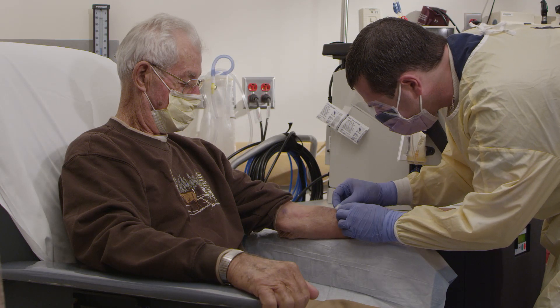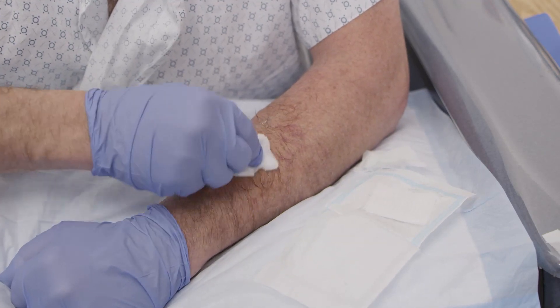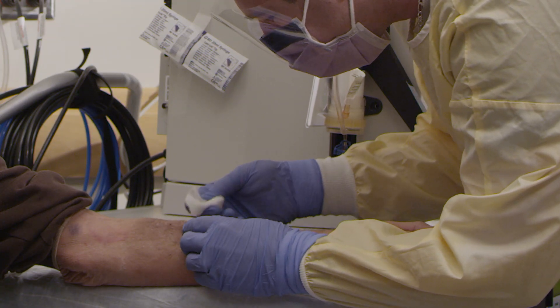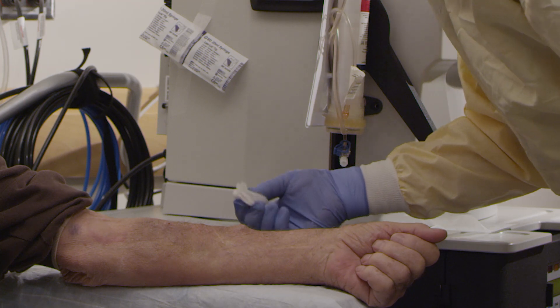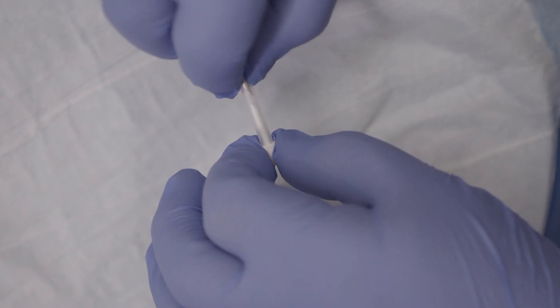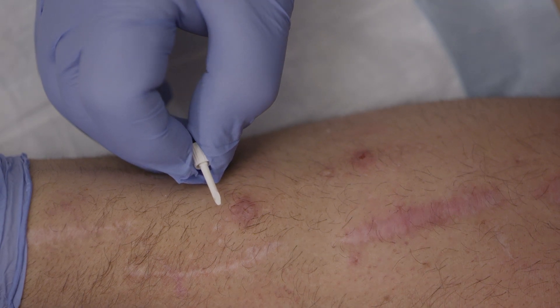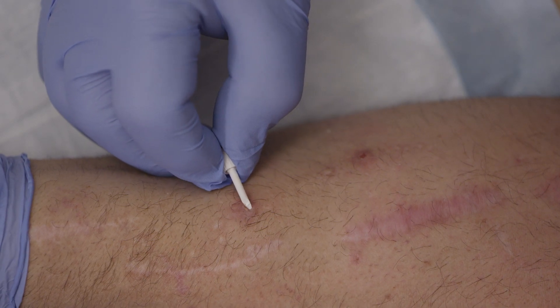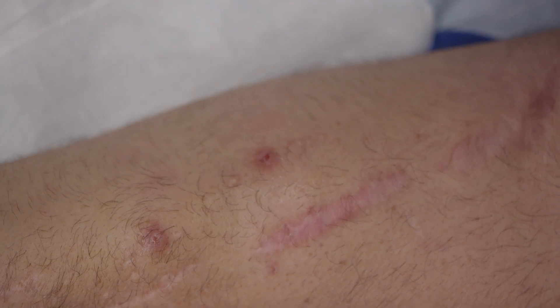During cannulation of the buttonhole site, there may be a scab present at the insertion site. It is very important to remove scabs completely before cannulation. Scabs may be removed during the initial washing step. If scabs remain and need to be further softened, use a gauze pad soaked with water, saline, or antibacterial soap, or an alcohol pad. To loosen the scab, stretch the skin in all four directions around the site. Remove the scab completely using a sterile gauze or scab removal device. Do not use needles to remove scabs. After scab removal, buttonhole sites must be disinfected again, as scabs harbor bacteria that may be spread during the removal process.